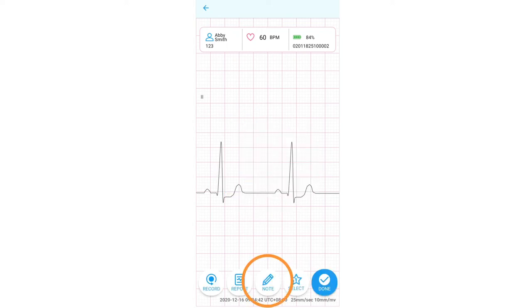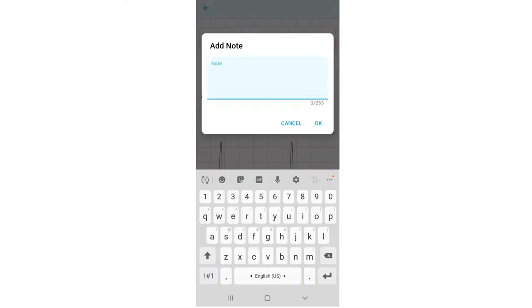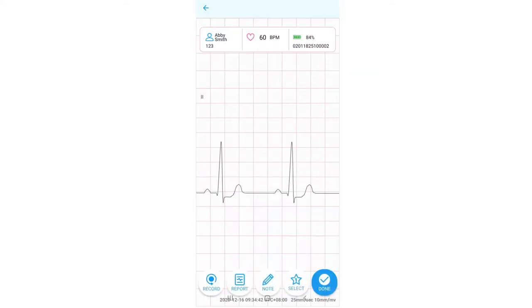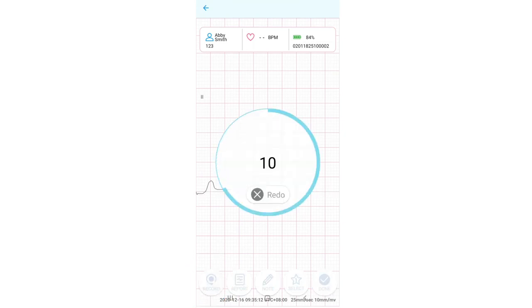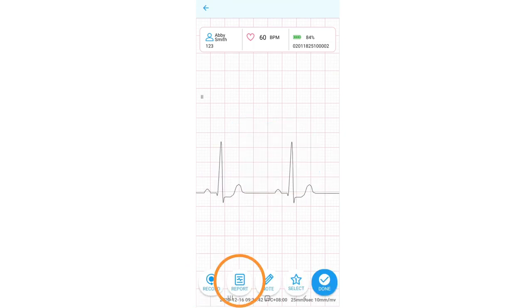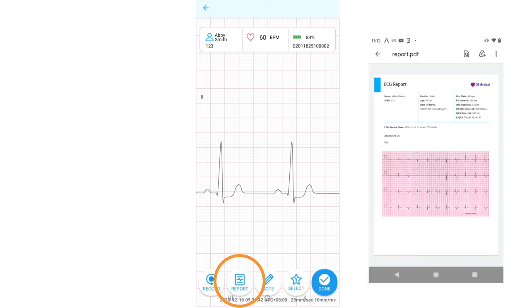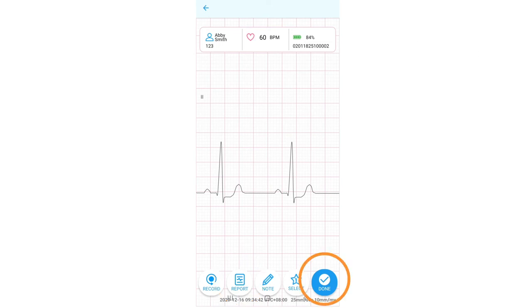You may press the note button to add a note to this recording. Press the record button to make another recording. Press Report to view the PDF file of the last recording you have done. Press Done when you are done recording.